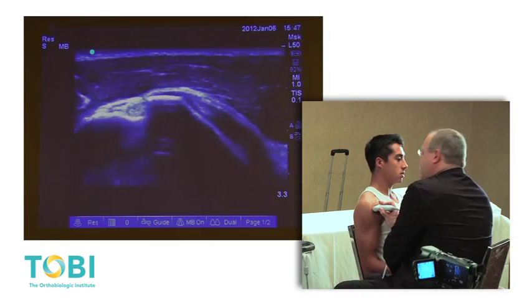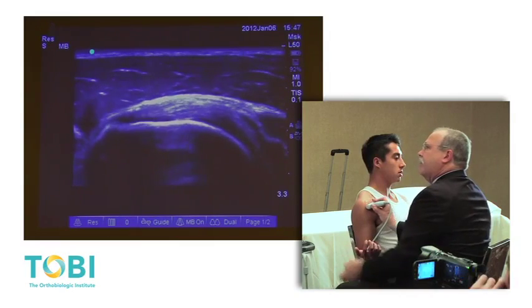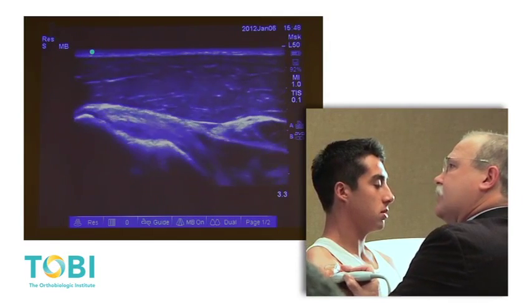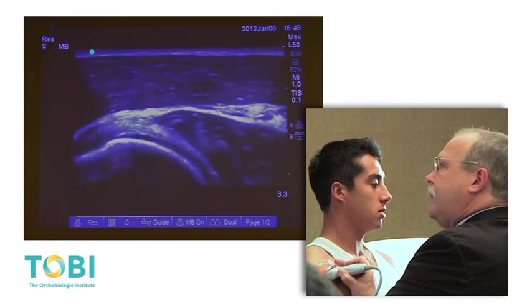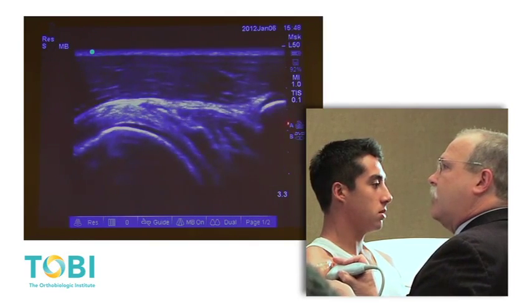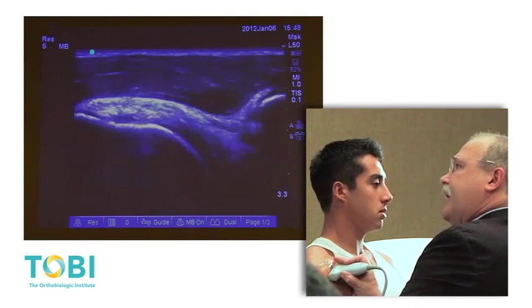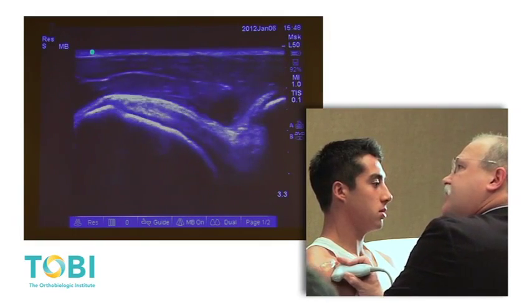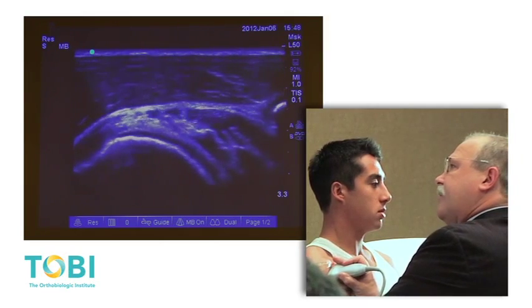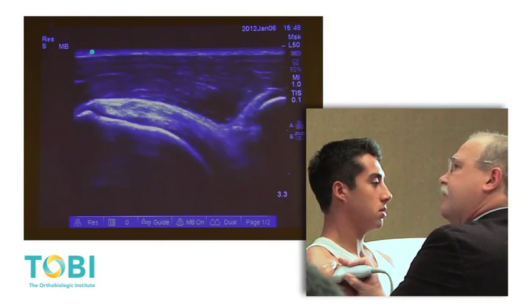Following interrogation of the biceps tendon, we're going to ask Kyle to externally rotate, and you see the subscapularis tendon come nicely out into view. And you can see with internal and external rotation dynamically how that muscle follows the motion of the tendon. Further medial, bony acoustic landmark of interest when you're doing ultrasound is the coracoid. And in this position, you can look at those structures past the coracoid and see if there's any element of snapping or bunching of that tissue as it passes the coracoid, for subcoracoid impingement, the presence of.